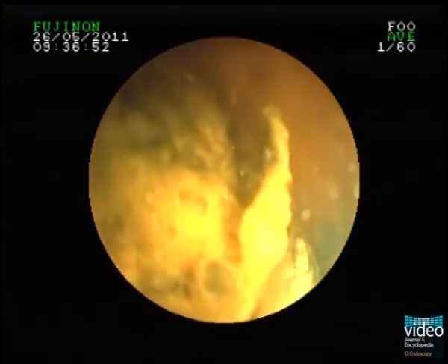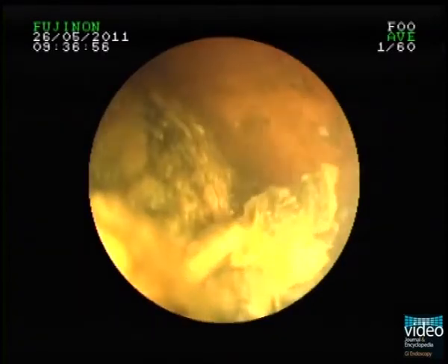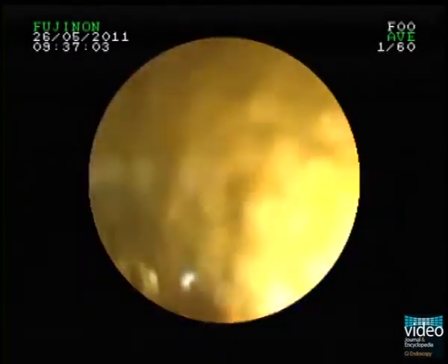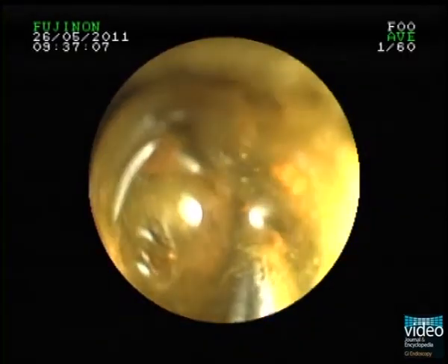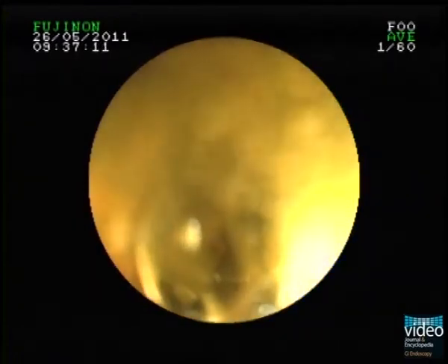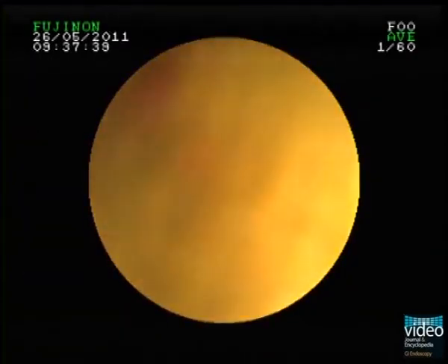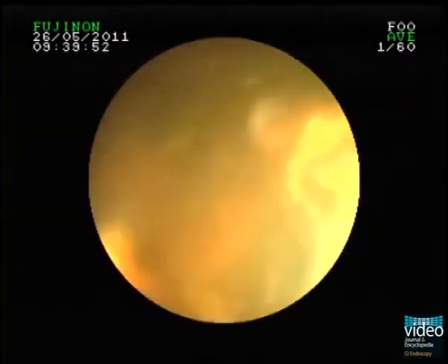A four-french electrohydraulic lithotripsy probe is inserted, and lithotripsy is carried out under direct vision with the tip of the probe touching the stone. Sparks are generated when the foot pedal is pressed. Special care is taken not to activate the probe when the tip is in contact with the bile duct wall; the probe is activated only when it is properly immersed in saline and touching the stone.